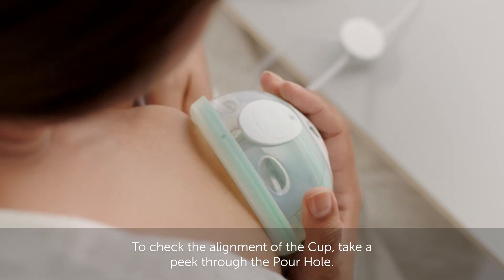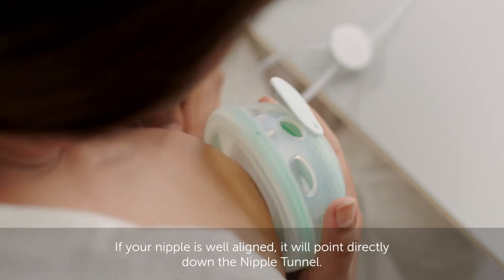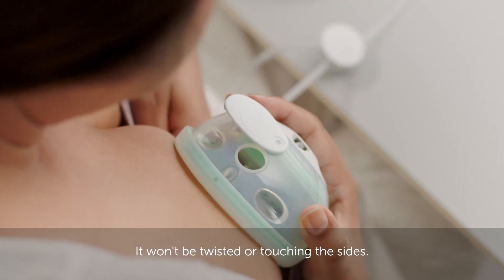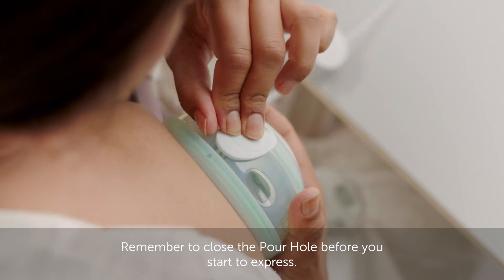To check the alignment of your cup, take a peek through the pour hole. If your nipple is well aligned, it will point directly down the nipple tunnel. It won't be twisted or touching the sides. Remember to close the pour hole before you start to express.